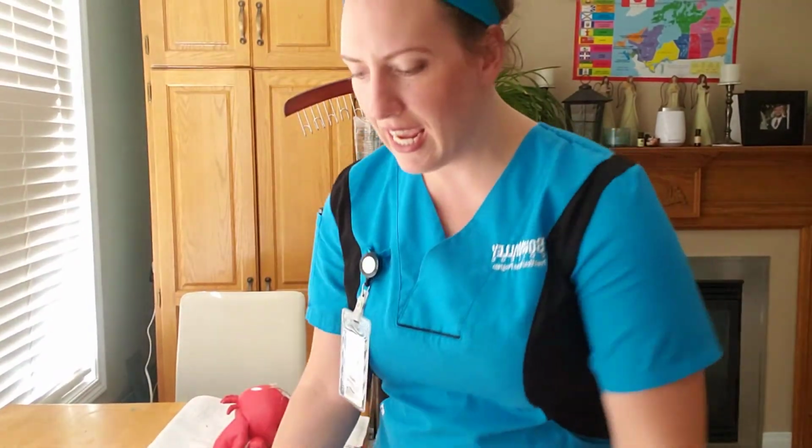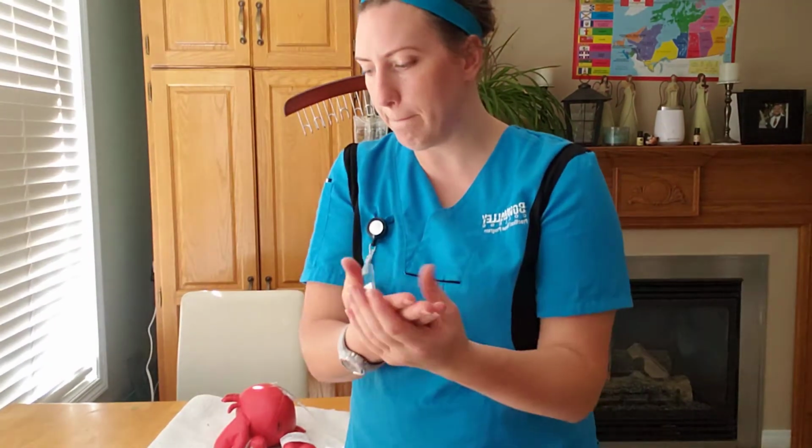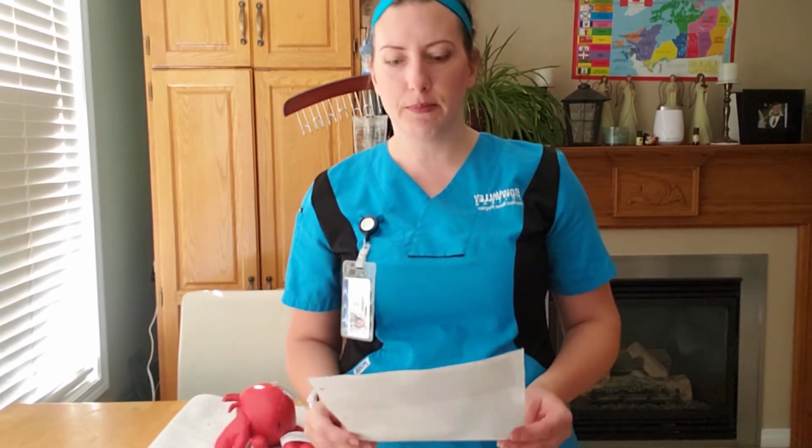I'm going to begin today by hand hygiene. Okay, so today's procedure is for Allison Chinook. She's a patient who's been admitted with right invasive ductal carcinoma, requiring chemotherapy and symptom management.